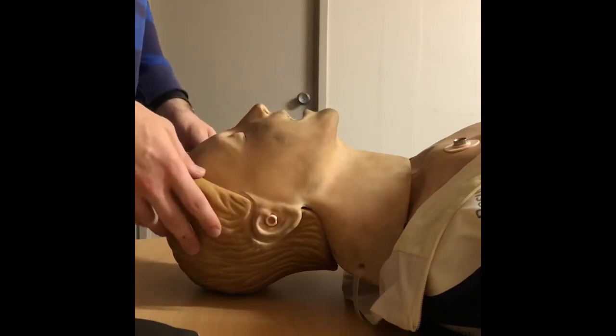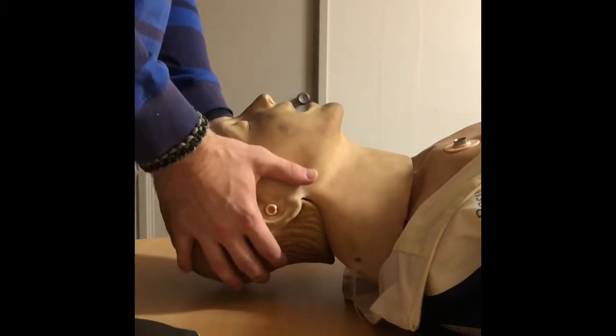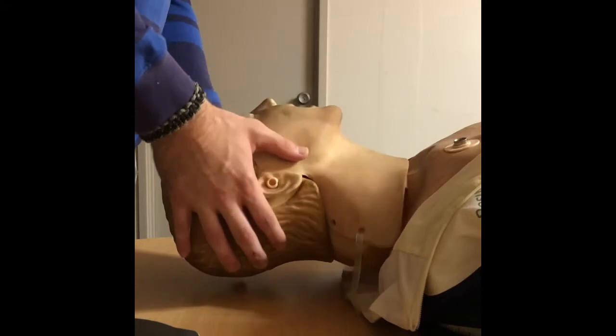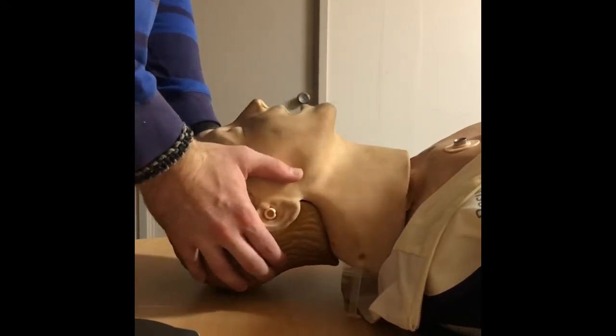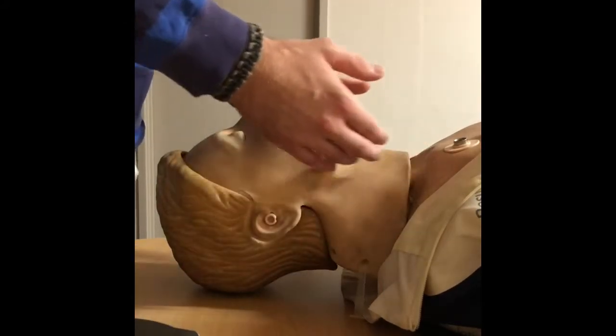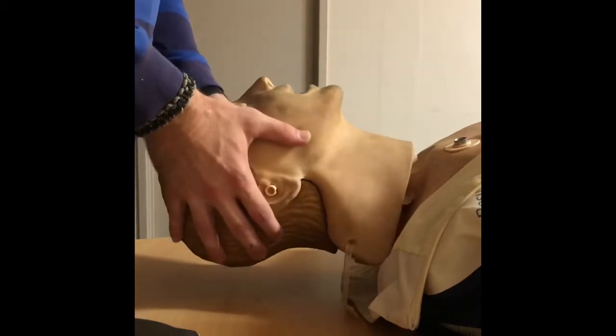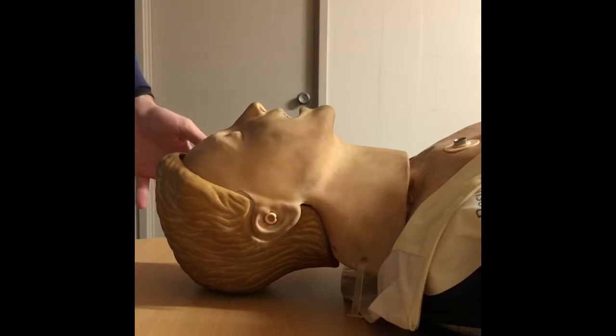Moving on to N, so neck mobility. This patient is non-traumatic, so we are free to move the neck around. There's free movement there as far as flexion goes, and anterior lift as well. There is some restriction in this mannequin for the movement of the neck anteriorly there. So let's move on to patient positioning.